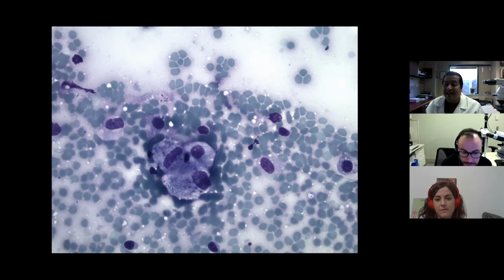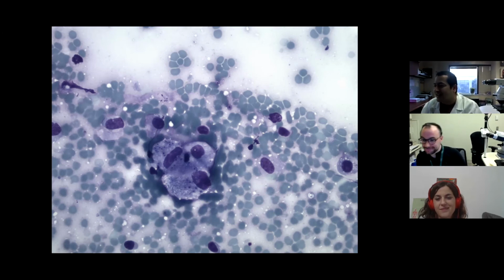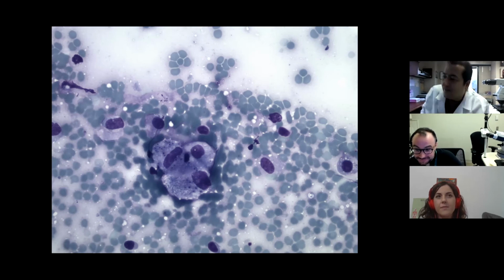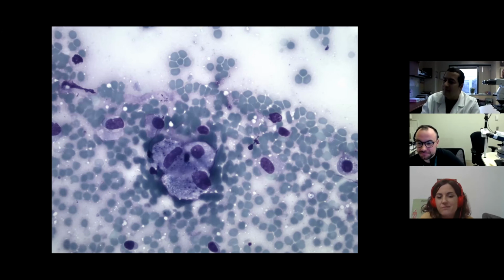That's why I love Cryptococcus. By the way, guys, that's why I made that huge tutorial on Cryptococcus, because that's one thing you will see in every part of the world, right? Everybody sees Cryptococcus everywhere. Isn't that correct? Do you guys see crypto, right? I don't get many biopsies of infections. I don't know why. I love to see these tweets because I don't get many of these biopsies. I see more TB, tuberculosis, but when I see fungus, I keep it in my archive because I'm so happy when I see this yeast.